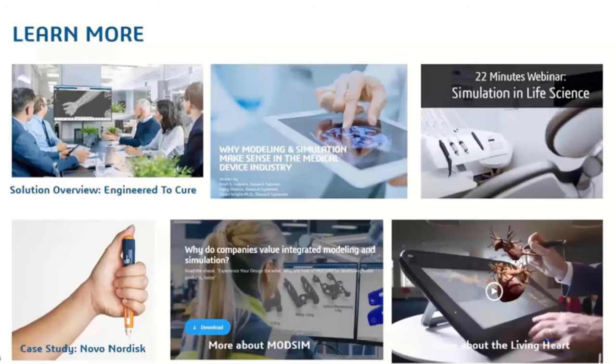There are some areas today, particularly, for example, MRI safety, where computational modeling is accepted as proof of evidence that your device might be safe in the human body, which means essentially you can completely bypass physical testing and submit your results from computational simulation alone as proof of evidence. And in some other cases, you can support or augment the physical evidence that you have by providing additional computational simulation. So the goal is eventually to move towards a much broader acceptance of simulation results, both for design as well as for the approval process.